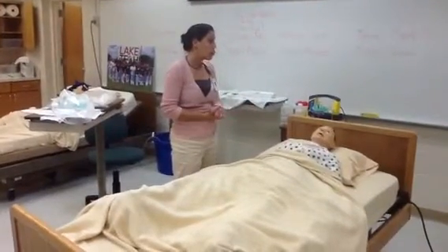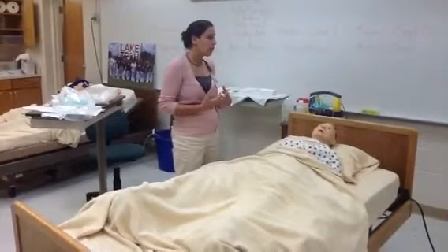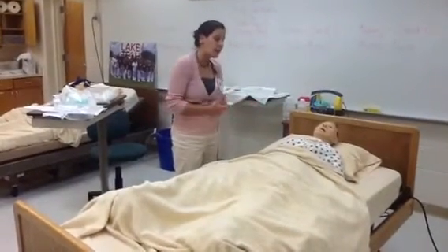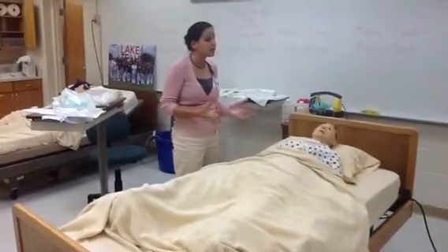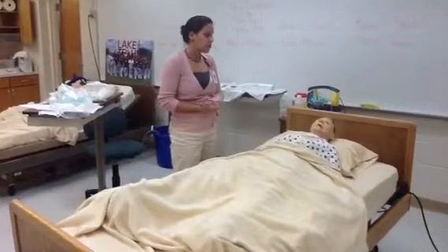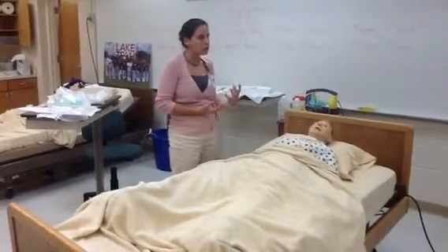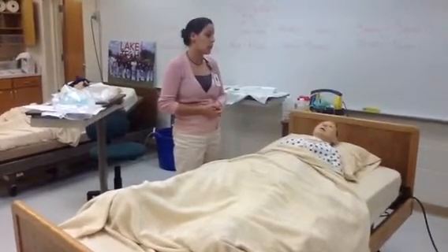We've put the catheter into your bladder. It will be a little bit irritating for your urethra. It may actually provide you the sensation that you need to pass urine. It's okay. Please relax that musculature because there is a catheter in place and it will collect all that urine. So even though you have the feeling or that urgency to go, we have something in place to take care of that. So please don't worry about that.